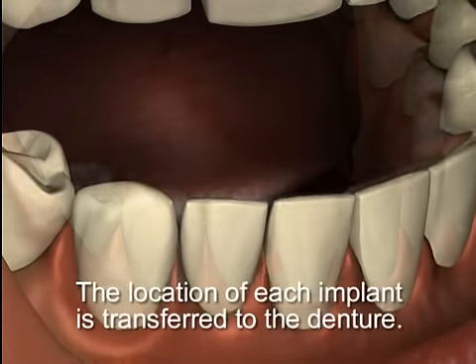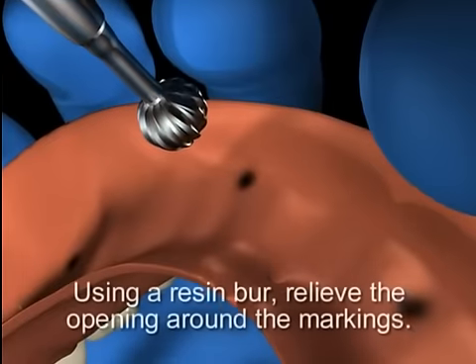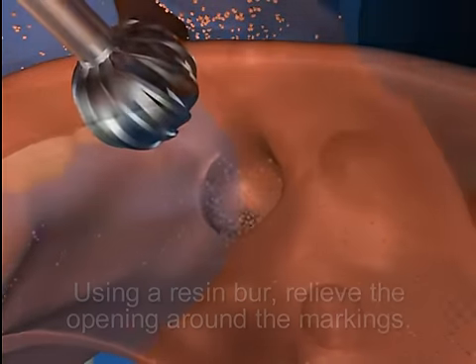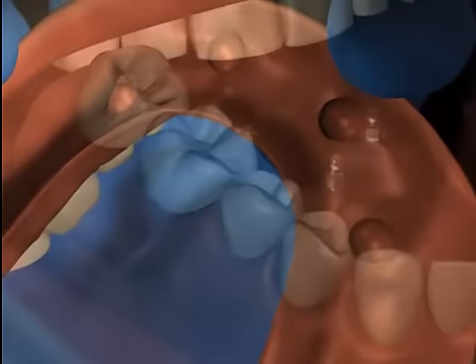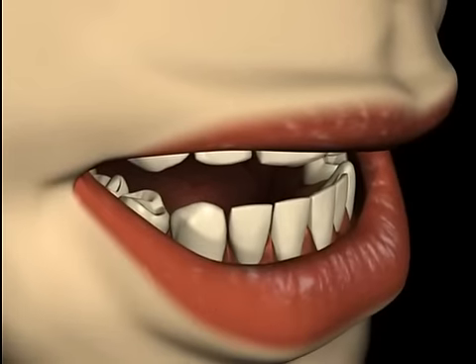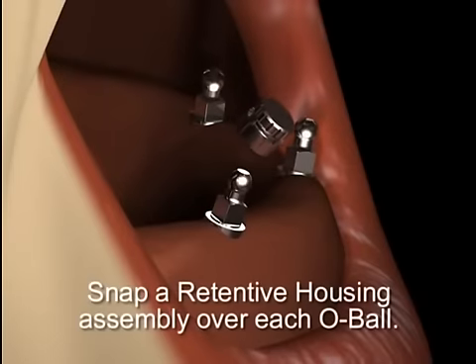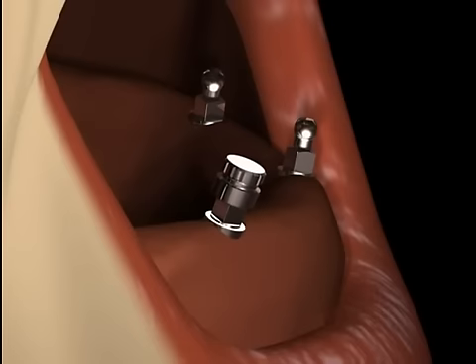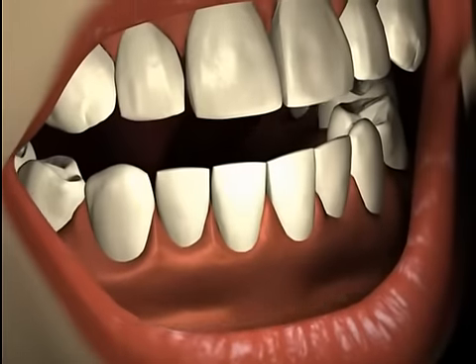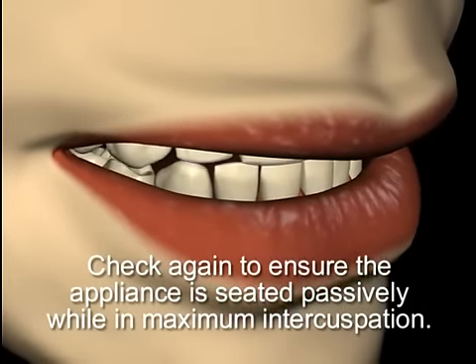The location of each implant is transferred to the denture. Using a resin burr, relieve the opening around the abutment impressions or markings in the denture by approximately 5 millimeters. Try the denture in the patient's mouth and verify that the appliance is seated passively while in maximum intercuspation. The O-balls should not touch any part of the denture. Snap a retentive housing assembly over each O-ball. Try the denture in the patient's mouth again and check to ensure that the appliance is seated passively while in maximum intercuspation.